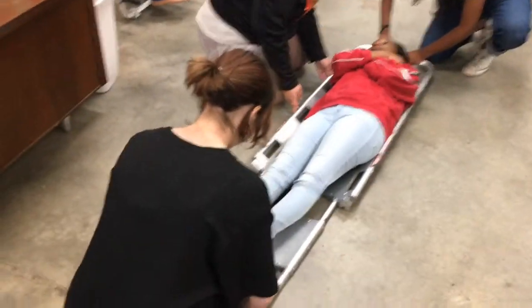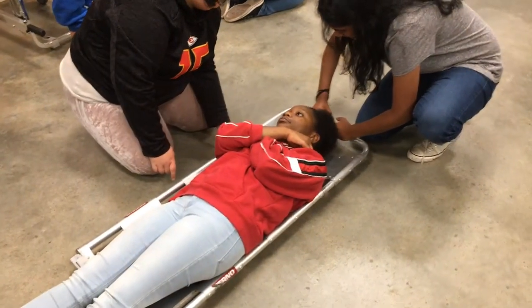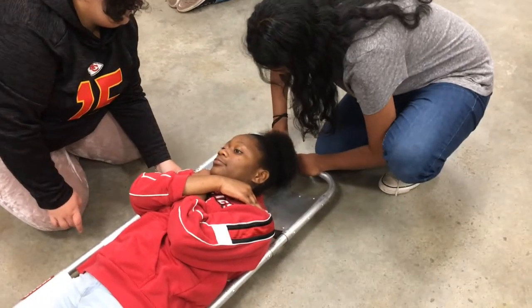After that, you want to lock the scoop stretcher in place again at the foot end and at the head end. Make sure that the patient doesn't get caught in it — that their hair or any clothing doesn't get caught in the stretcher.